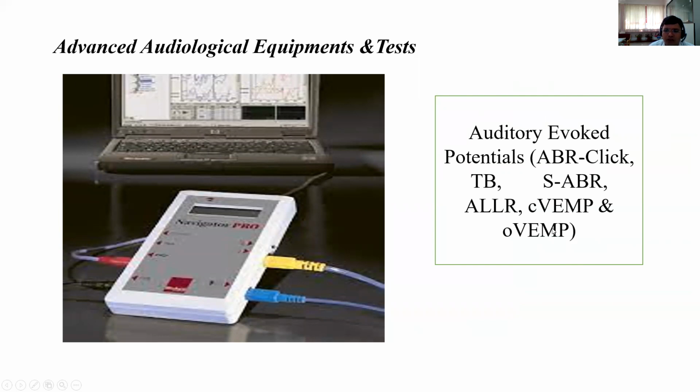All these potentials you can record with a single evoked potential system, provided you have the hardware as well as the software to operate these potentials.